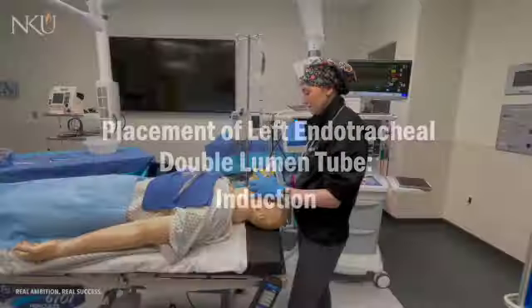Next, I'm going to inflate my tracheal cuff, attach my connections, and attach my circuit. At this point, we should be confirming the tube placement with end-tidal CO2.